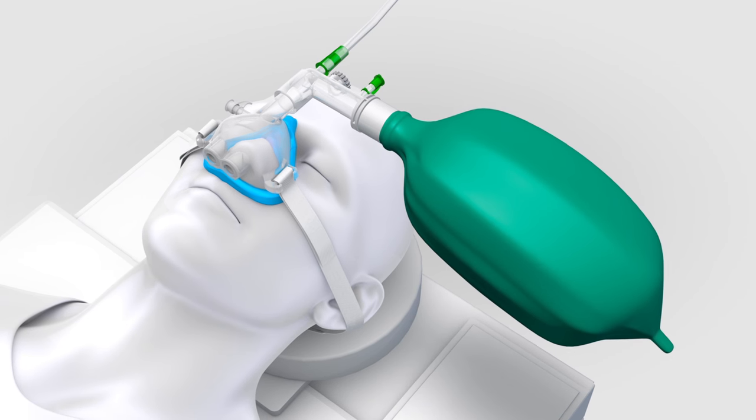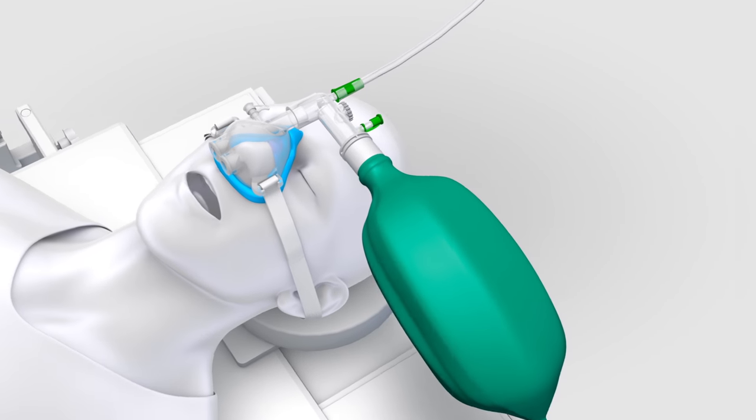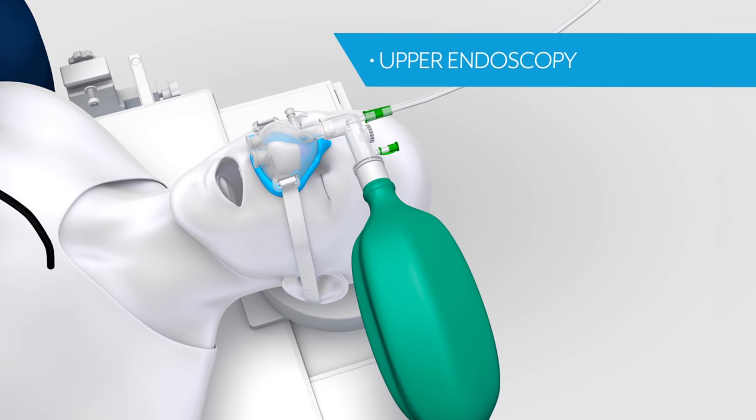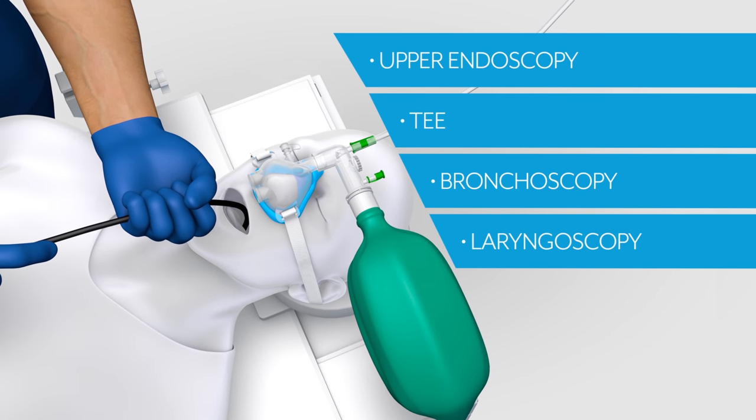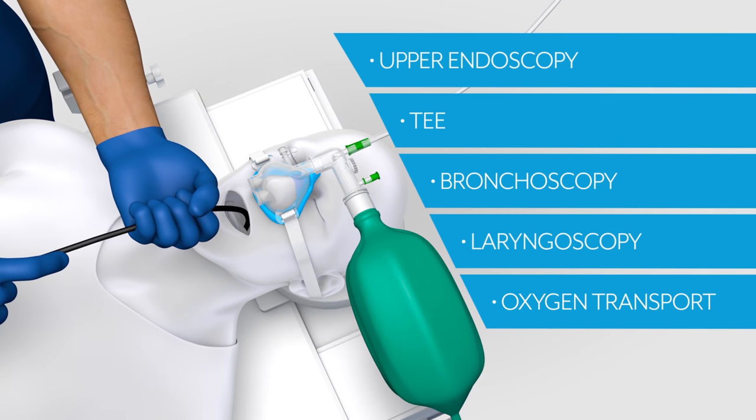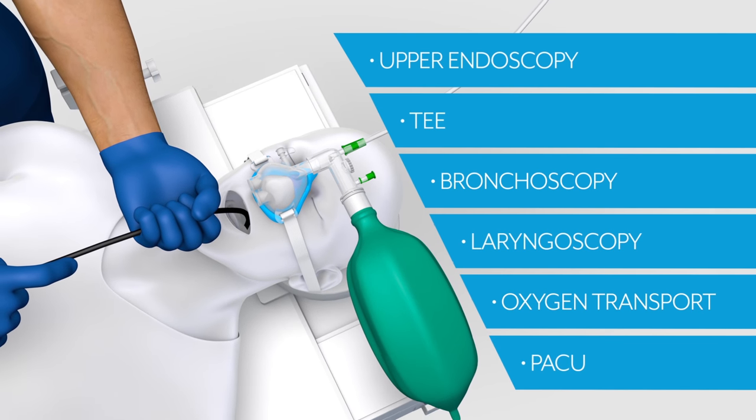Since the Supernova only covers the patient's nose, it is ideal for procedures where the provider requires access to the patient's mouth, such as upper endoscopy, TEE, bronchoscopy, and laryngoscopy. It has also been used for oxygen transport and in the PACU with the hyperinflation bag to provide continuous oxygenation.